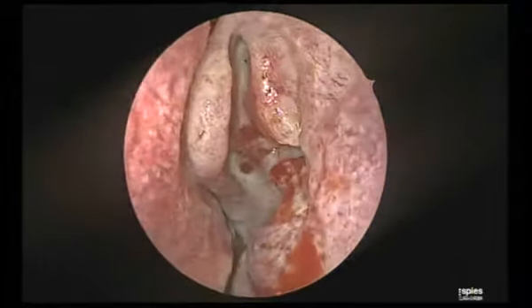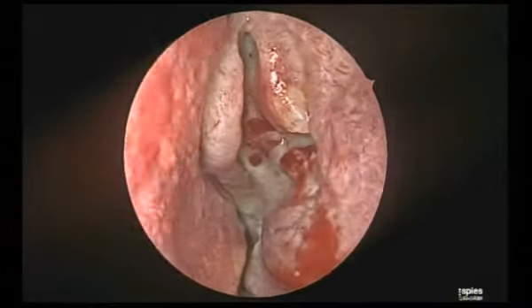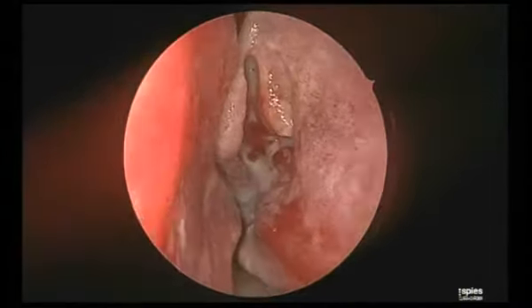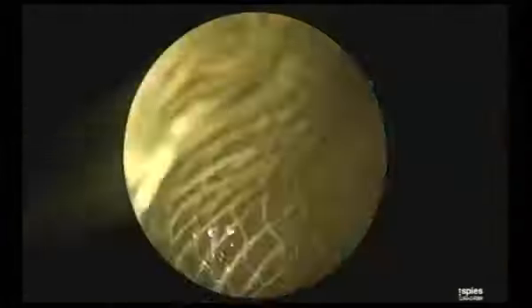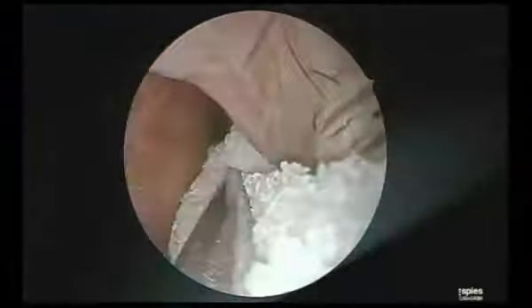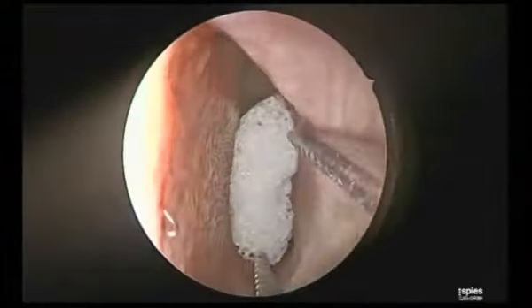Now, can you see something? Yes, we can see. This step is known as infundibulotomy. This is opening the three-dimensional infundibulum. Can you see this? Very nicely. That is infundibulotomy, the simple step. And this infundibulum is the space where the sinuses drain into.